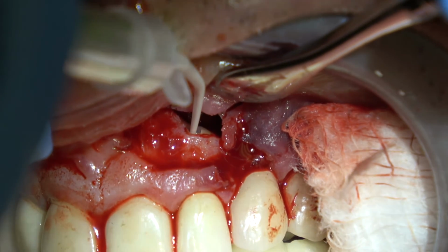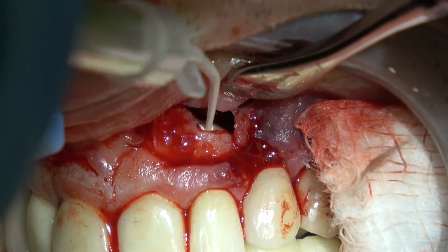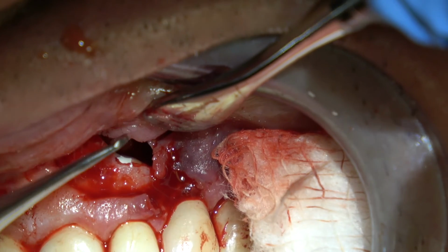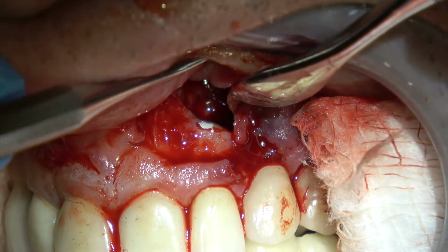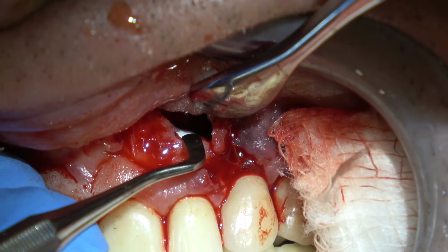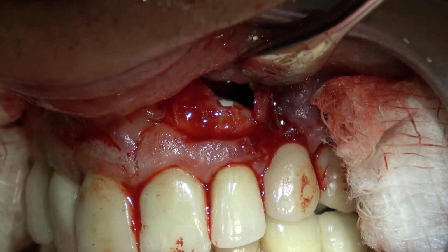Keep the tip of the syringe all the way to the bottom of the hole and let it fill up. Don't move it up and down because you don't want to incorporate any air bubbles in the filling material. This sets up rather quickly, so let it go ahead and set before you place the platelet-rich fibrin.